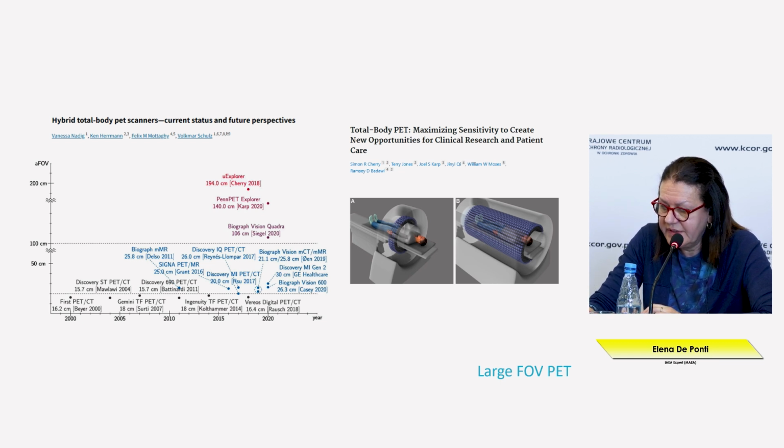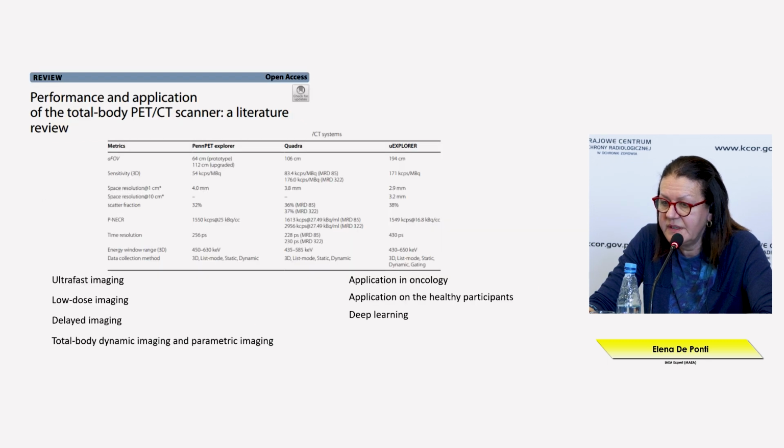And so there is a big impact on the efficiency in collecting coincidences and reconstructing images.